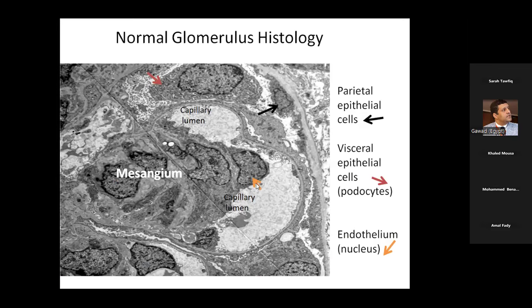According to the cut, we can imagine that any nucleus is like a ball. If you cut at the periphery of the ball, it is a small circumference, a small diameter. If you are nearer to the center, you will have a bigger diameter, and so on.